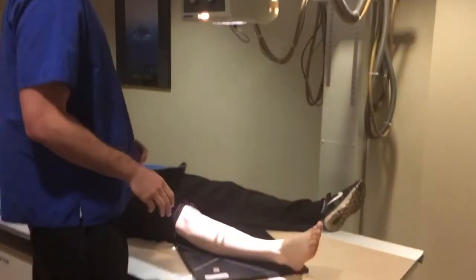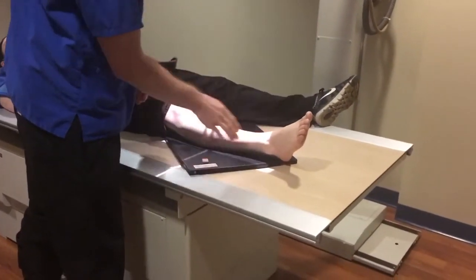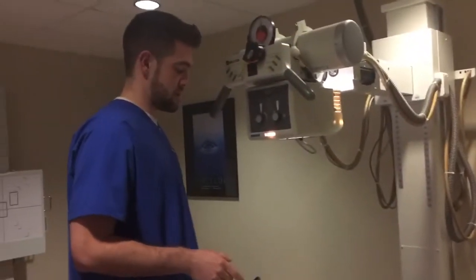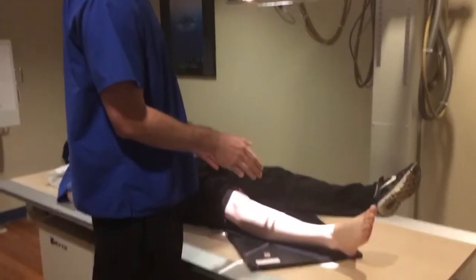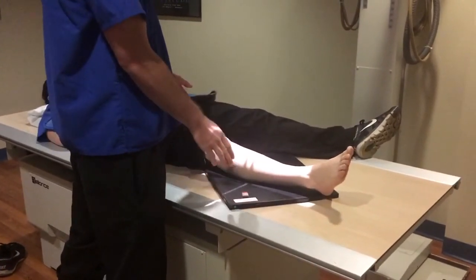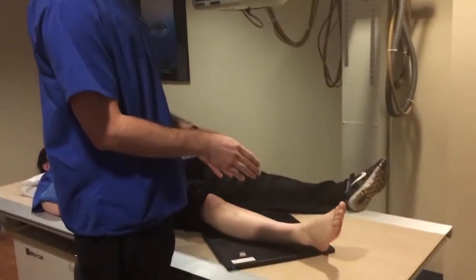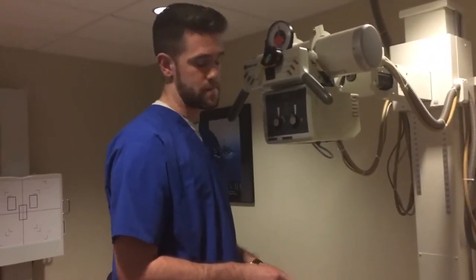Now, since my patient has a longer leg, I had to rotate the cassette diagonally in order to fit the whole part on. If you still cannot fit the whole part on using this method, you should at least get the proximal joint with the 14 by 17 and then use a 10 by 12 to image the rest of the lower leg, including the distal joint.